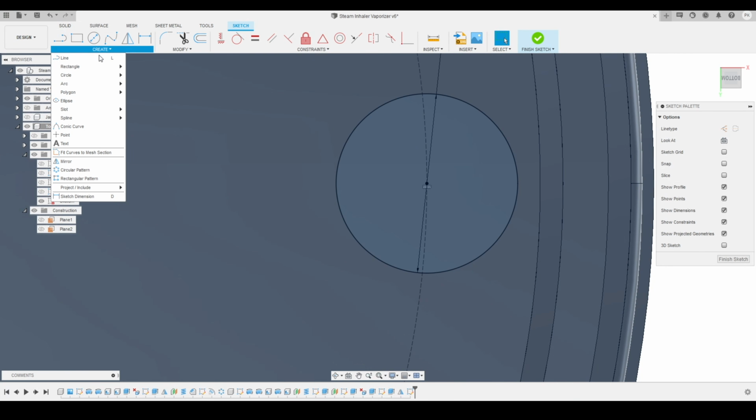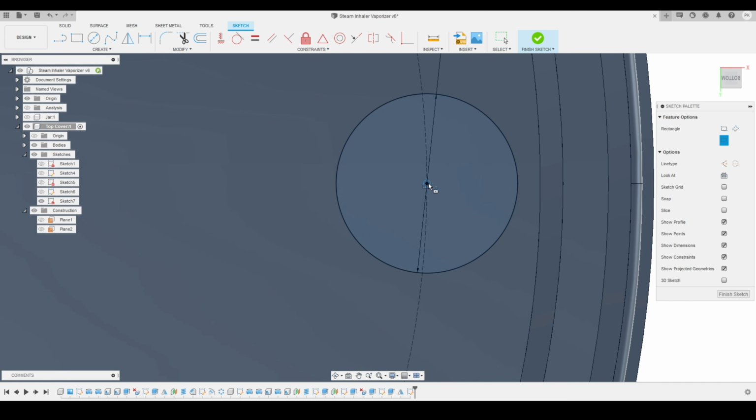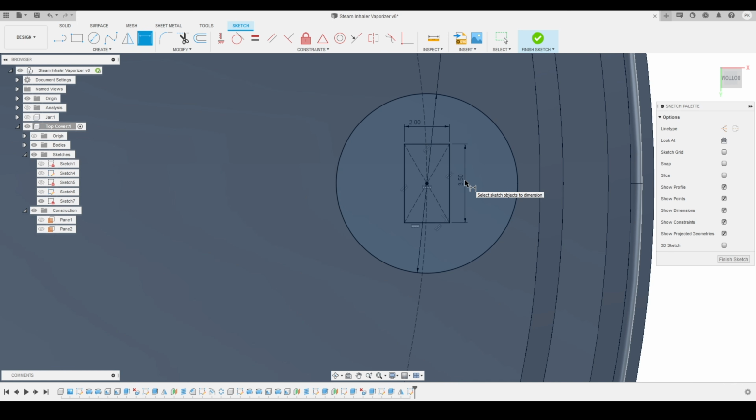Now I will go on to the create panel over here again, and we'll go on to the center rectangle. Here you can see I will activate the tool and we'll create a rectangle like this, and I'm going to define the dimensions of the sides of this rectangle. So this side I want to keep 2 millimeter, and the other side I just want to keep, I think 3.5 is not going to work, so I have to change this one. So I will just change that to 5 millimeter for this rectangle.